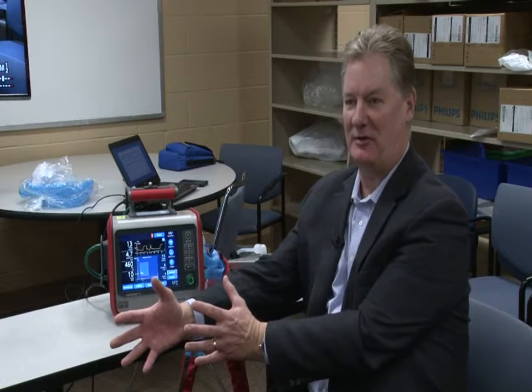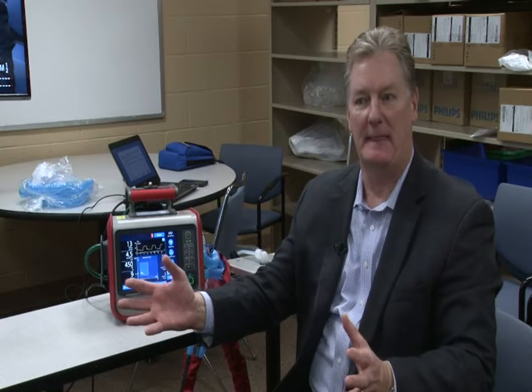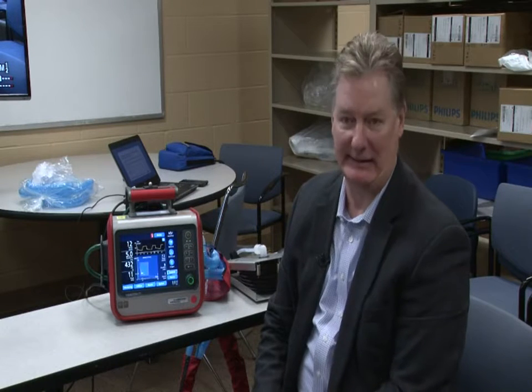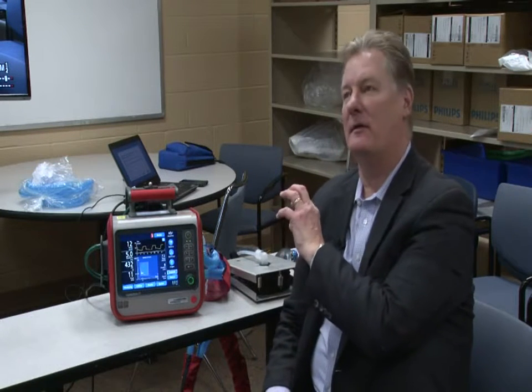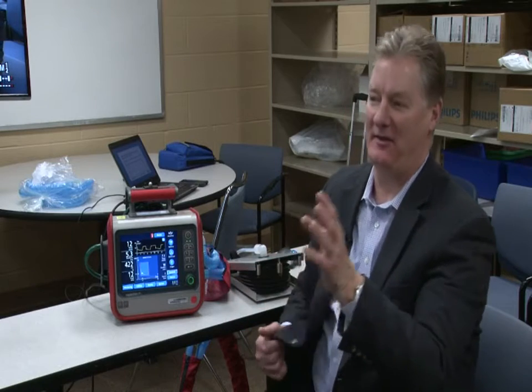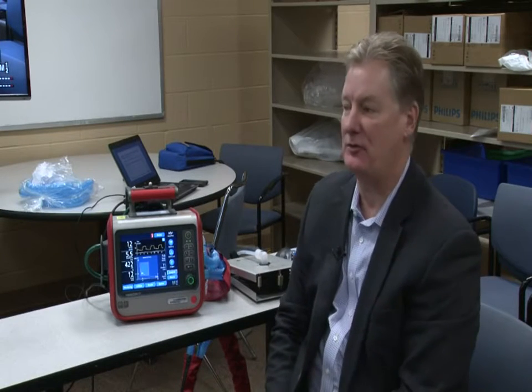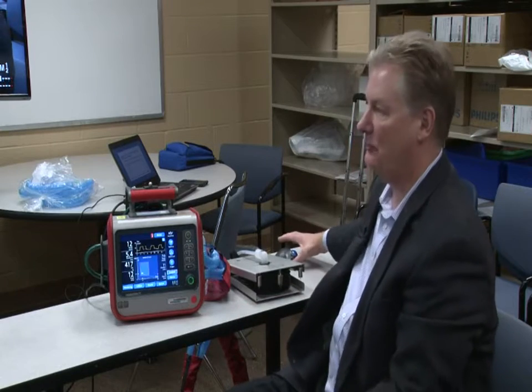a spontaneous breathing trial is little or no support from the ventilator for a period of time, and hey, Phil's ready to be extubated and we pull the tube, right? Do you want to have a patient with one of those disease processes breathing 40 times a minute and the ventilator's not doing any work? Probably not, right? So the benefit of ASV in your situation, one of the benefits works against us. That's why we're calling Plan B what would be the mode we would use. And so we would use that PSIMV plus mode for those types of patients.